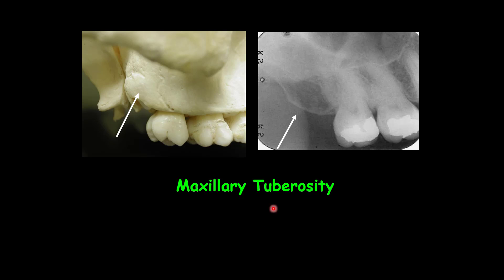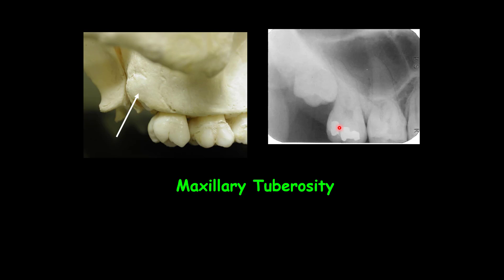The maxillary tuberosity is at the posterior lower part of the maxillary surface and is a kind of rounded eminence, especially prominent after the eruption of the wisdom teeth. This is the maxillary tuberosity on the periapical imaging — you can see it here, and underneath the maxillary tuberosity you can see a wisdom tooth that is still impacted.